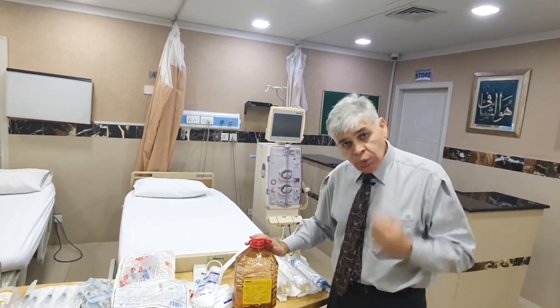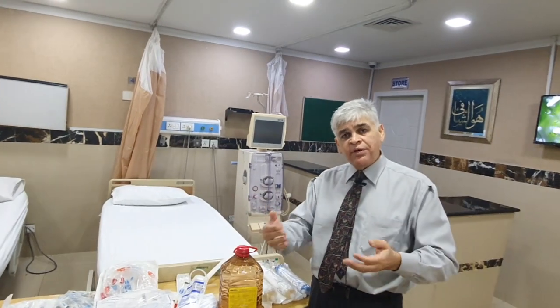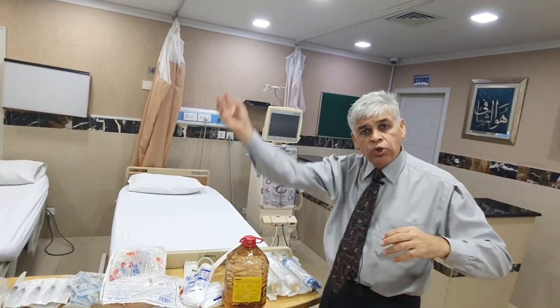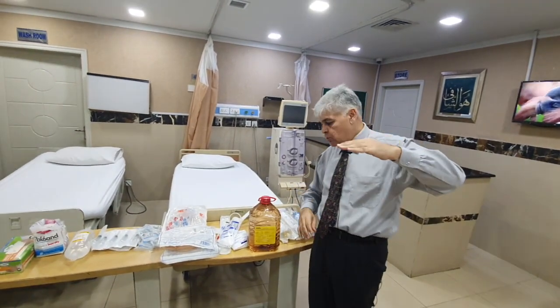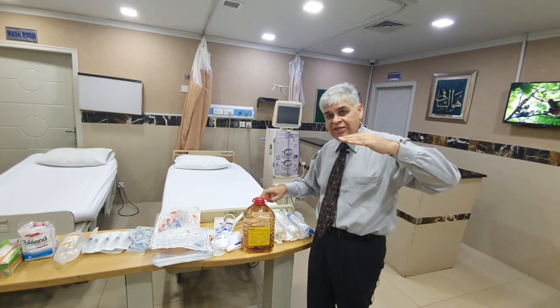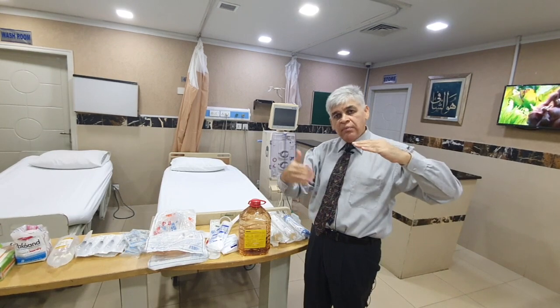It has to have sodium in it, because sodium is required for blood pressure. Once again, it's a matter of simple diffusion. If you don't have any sodium on the opposite side, the blood is going to lose all the sodium by simple diffusion, and the person is going to collapse within the first hour of dialysis. So you need to maintain a certain amount of sodium. This contains sodium, this contains chloride, obviously. This contains calcium, once again very critical, because calcium is going to drop by simple diffusion.